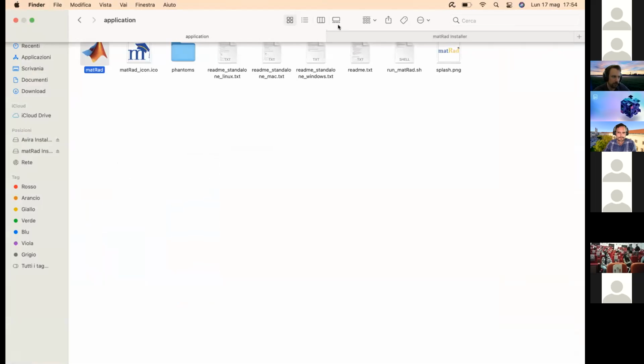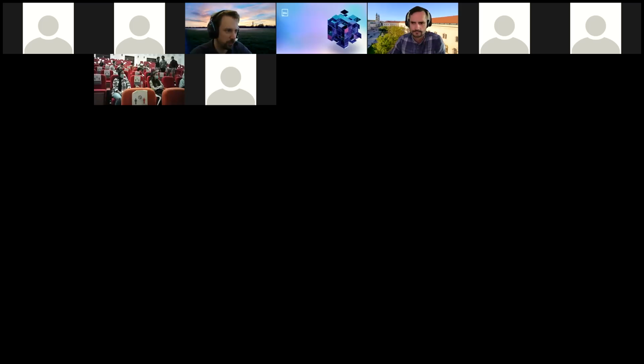Okay, I have one more question on the Google Docs. Why do you recommend to install from a source code over the standalone version?